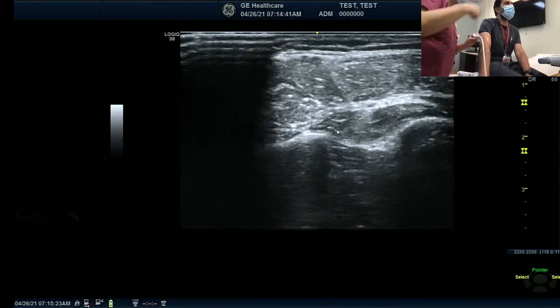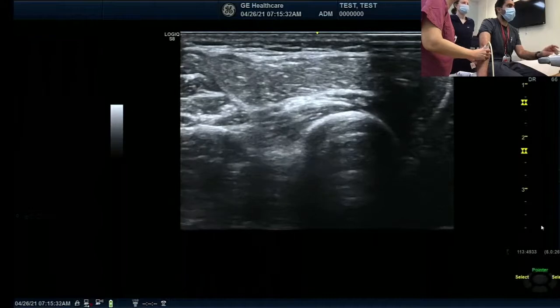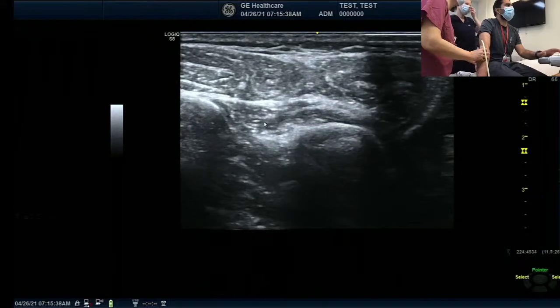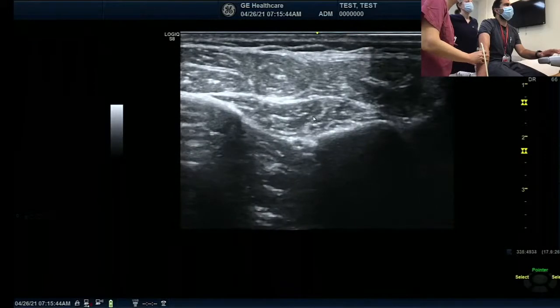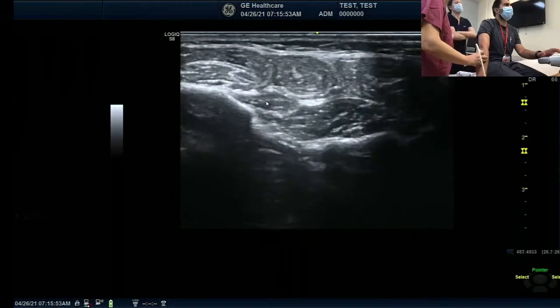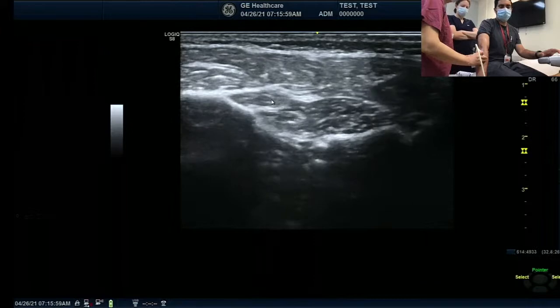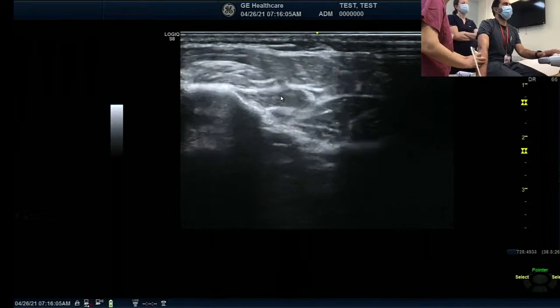Okay. So still you can see the supinator here. Let's go back to the supinator here still, right? Look at this supinator. I'm moving posteriorly, and that arrow, put the arrow on the APL. Yeah, the arrow is popping out now. As I bring it down, the supinator disappears. No more supinator. This is all APL. And if I move down, in the corner, some round muscle is popping out. EPL, whose origin is the ulna only. That's why you see EPL popping out now.